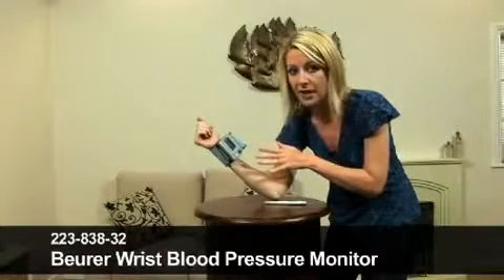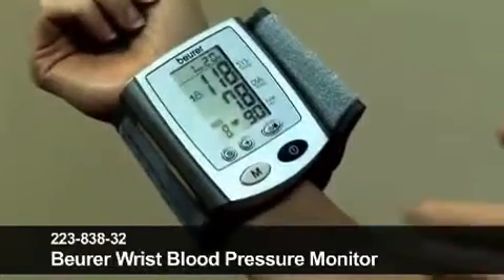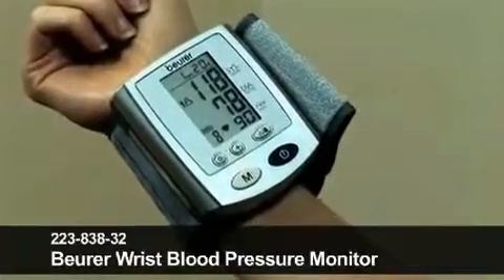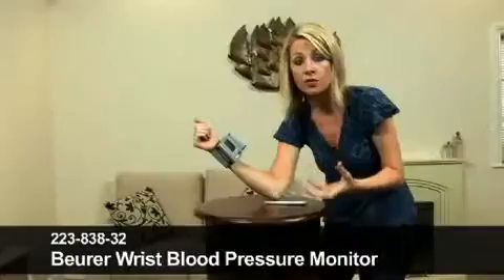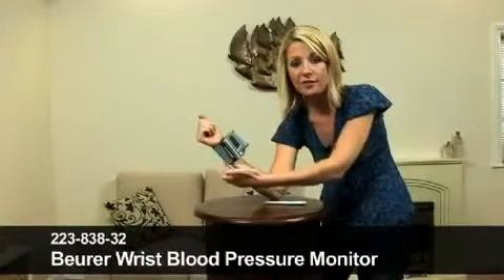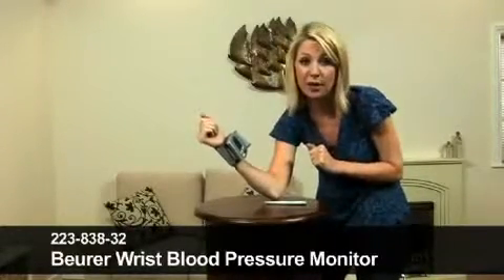What is also great about this is that it features 100 memory locations. If you need to keep track of this for fitness reasons on a daily basis, you can press the M button here — the memory button — and it will store your blood pressure and pulse on a regular basis. It comes with an automatic switch off as well, which is great. The batteries and storage case are also included, which is very handy. It's waterproof, and the cuff size — the grey cuff that goes around your wrist — is 13.5 to 22 centimetres. I've got very small wrists and it fits mine, no problem at all.